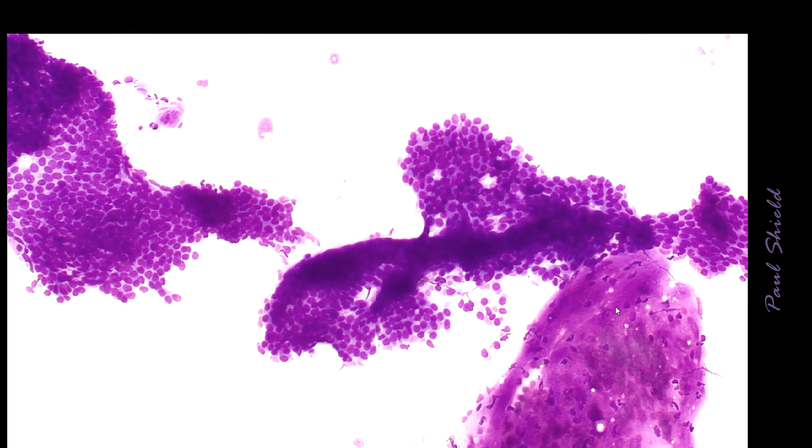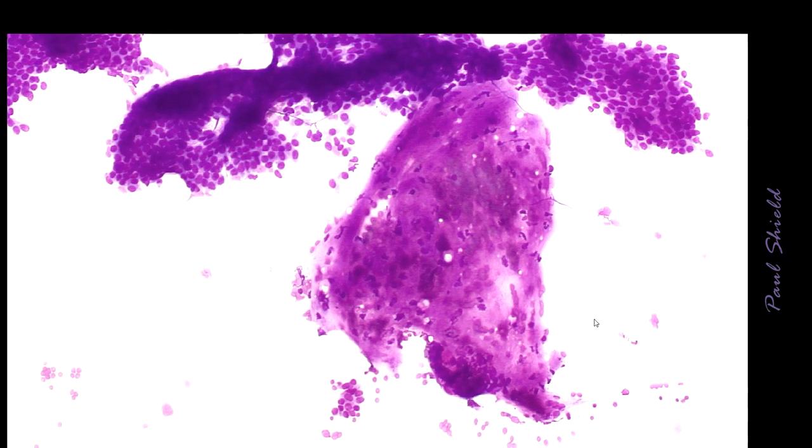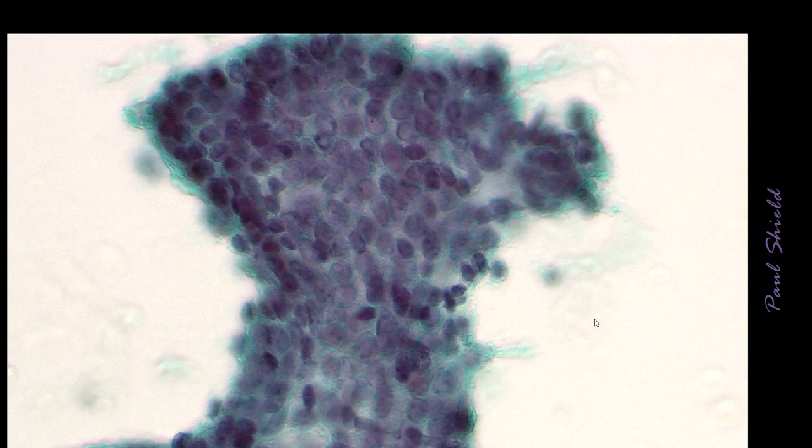Just here, this amorphous metachromatic material down the bottom is stromal tissue. And remember, this is a biphasic tumour consisting of epithelial proliferation and stromal tissue. This is a classic appearance of fibroadenoma epithelial cells, with a branching, staghorn appearance to the cells. Just on low power again here, notice how cohesive these epithelial cells are. They have rounded edges, some branching of the cell groups, and are very tightly cohesive.